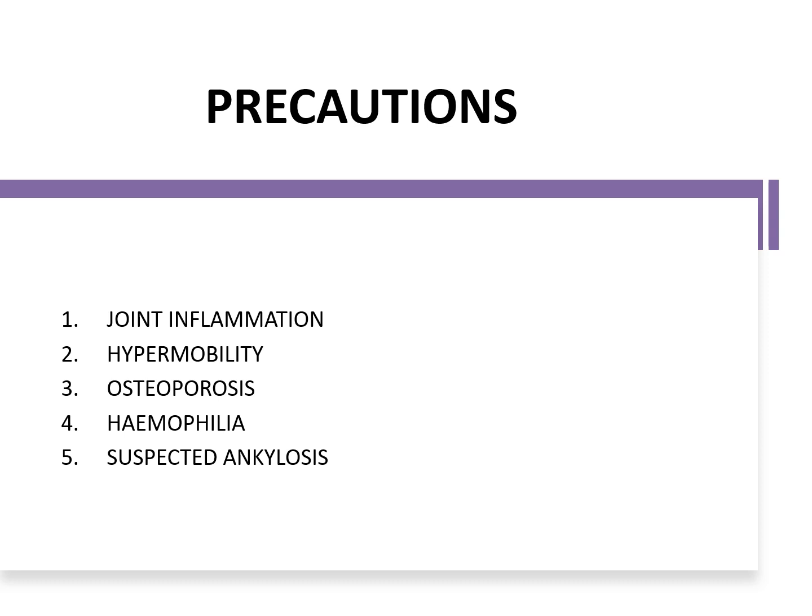Now coming to precautions. When you are doing goniometry, you should be aware that if the joint has inflammation, that means the patient will have pain, the patient may have swelling. So your range of motion can change if the patient has pain and swelling. It won't be very accurate, and it may cause pain to the patient also. So you need to be cautious. You need to be slow with that patient.